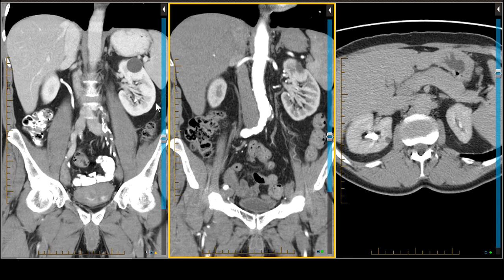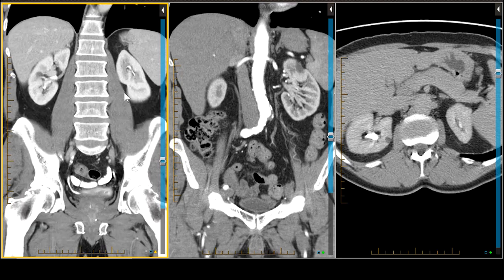It would have been helpful to have a base non-enhanced CT. We don't do them in every single case, but it is helpful to have a pre and post, especially when making that evaluation. Another caveat: the patient in 2017 had a round, smooth, close-to-water-density mass on the left side that actually got smaller. It's not uncommon for a cyst to shrink — sometimes they grow a little, and they can even have a little hemorrhage over time. So change alone is not necessarily a criterion to call something malignant.